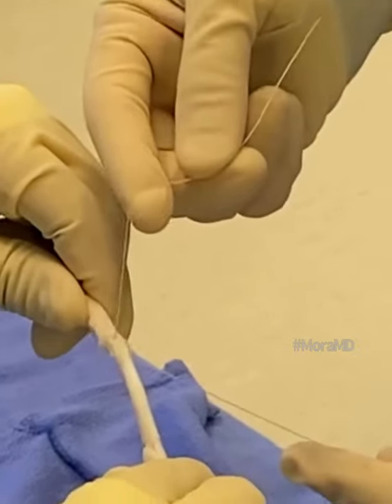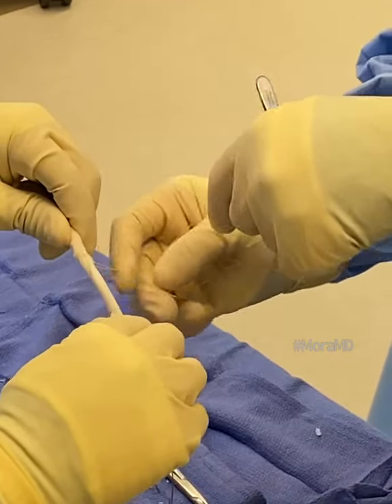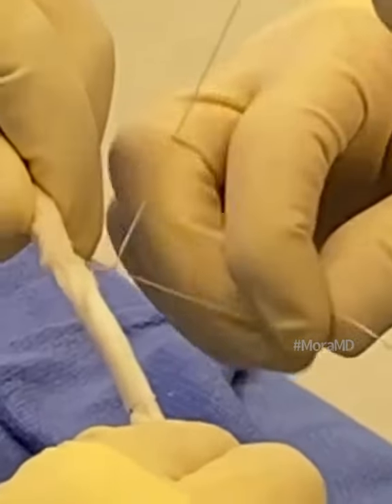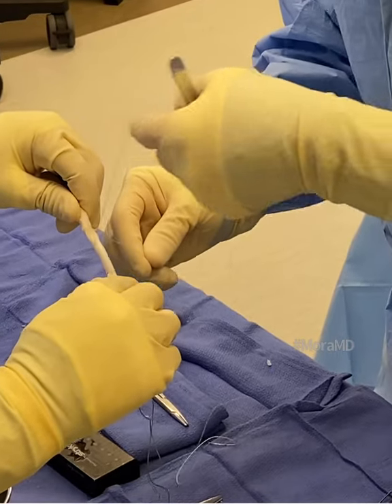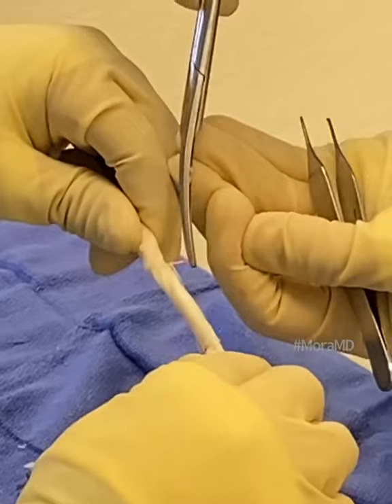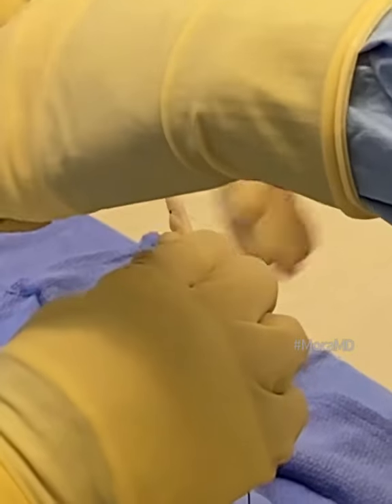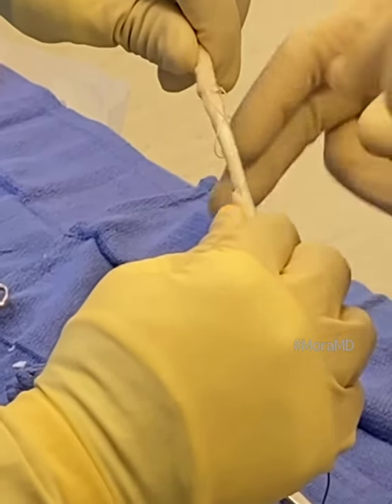I'm finishing up the graft preparation here. I'm using a suture to snug up the tendon part of this allograft. The reason I'm doing this is so that as I pass it through the tunnels — the walls of the tunnels are rough — the graft won't get snagged or damaged as it passes through. So I keep it nice and tight as it goes in. I'm doing these half hitches.